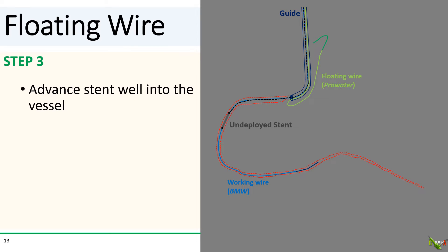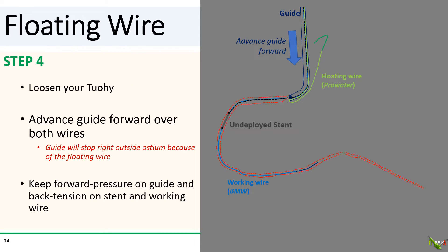Step three: advance your stent well into the vessel, well beyond the ostium. Step four: loosen your Touhy-Borst and advance your guide forward over both the floating wire and the stent delivery catheter. Keep advancing the guide until it stops advancing. The floating wire will stop the guide right at the ostium — then keep maintaining forward pressure on the guide and back tension on the stent and the working wire.